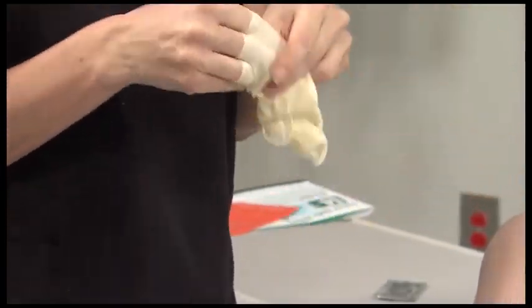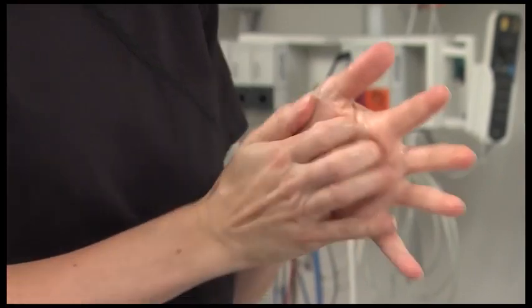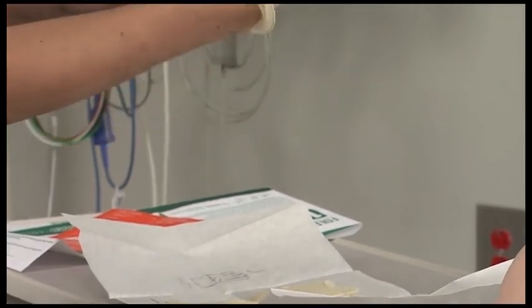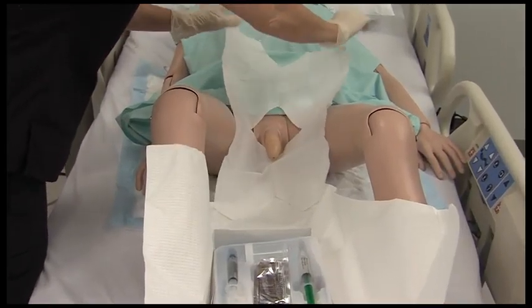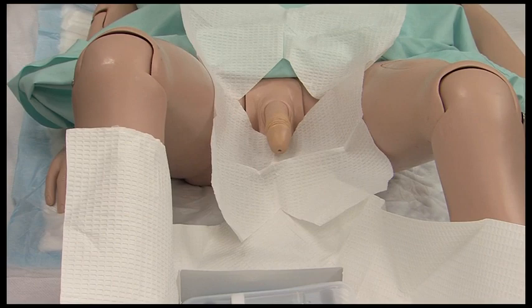Remove and discard your soiled gloves. Perform hand hygiene with the provided alcohol hand sanitizer gel. Open the final fold of the wrap. Don the sterile gloves while maintaining sterile technique in an area outside of the wrap. Position the fenestrated drape over the external genitalia so only the penis is exposed. Use caution not to contaminate your sterile gloves.